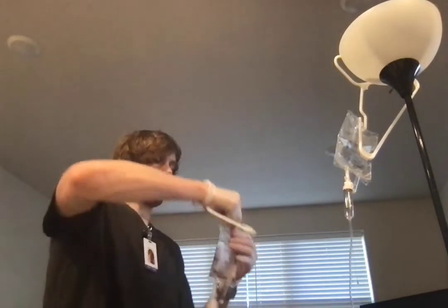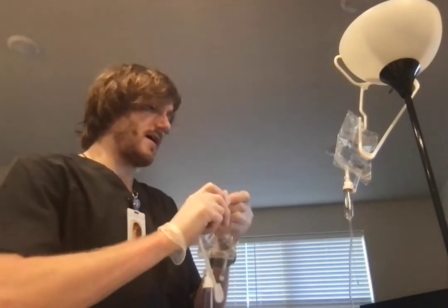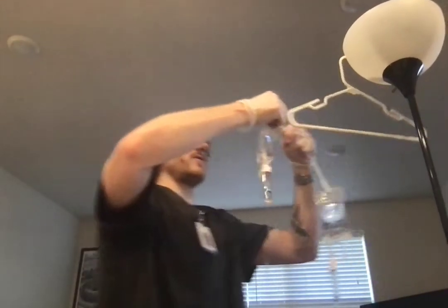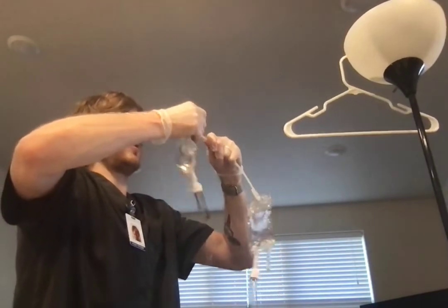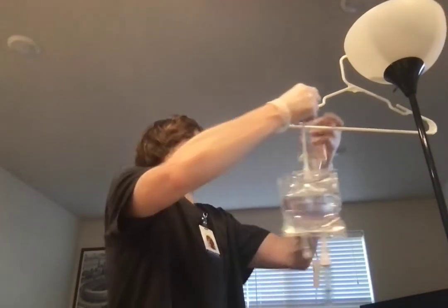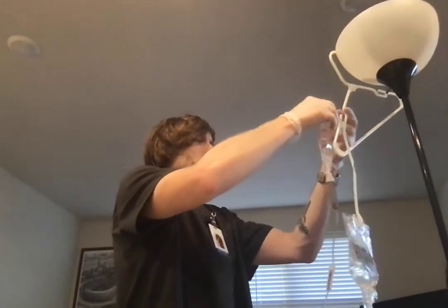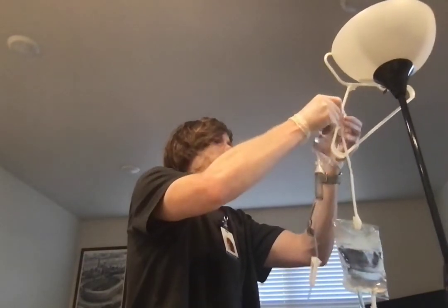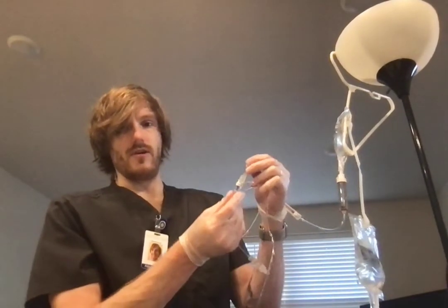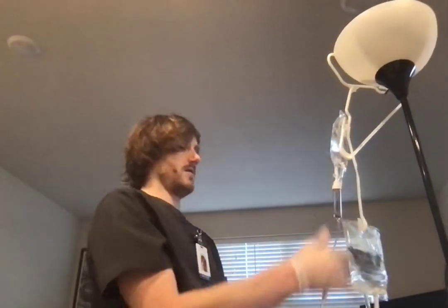Another thing with this too, it's called a hanger. I'm going to want to piggyback this antibiotic over these normal saline regulars. So what we do is you would just put one part of the hanger like so, and then the second one would go right here. So now it's almost like the antibiotic is getting piggybacked from the normal saline because the amoxicillin is going to eventually attach into this lower lock. So we're going to want to make sure that our drip rate is good.